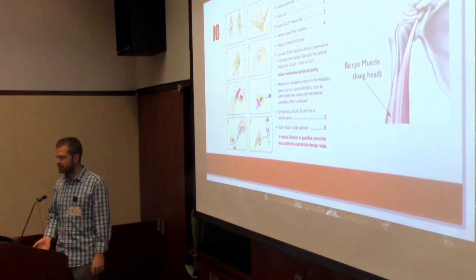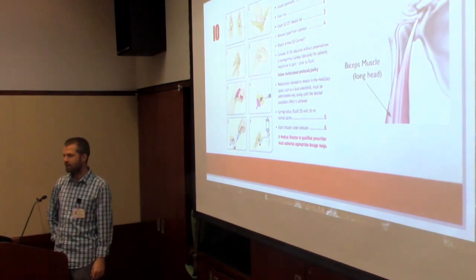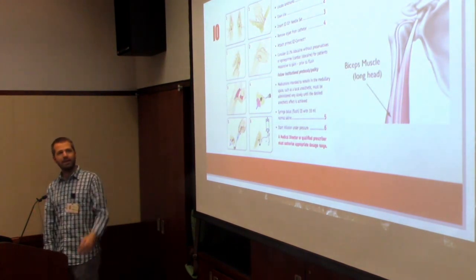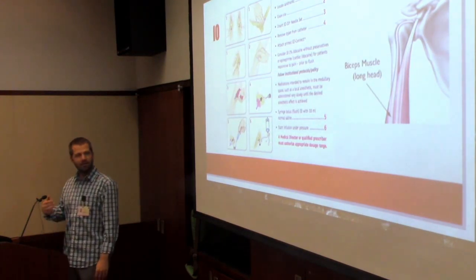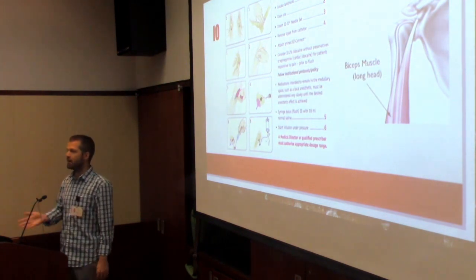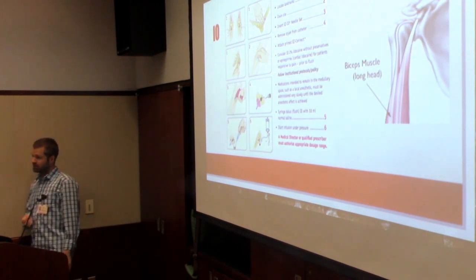And one of the first things they tell you to do is thumb to bun. And I was like, well, why does that matter? And they pull out a picture and they show you it and they go, okay, well, if the person's arm is out and you drill in right here, you're gonna go right through that tendon. And I had never thought of that. I think I put in like 6 or 7 in someone's arm and I've never ever rotated their arm or even known that that was a thing. And so I feel kind of bad.